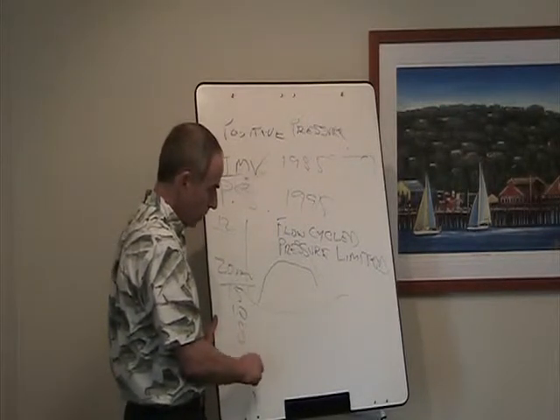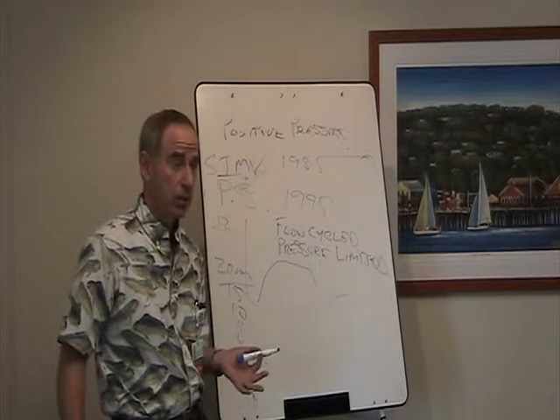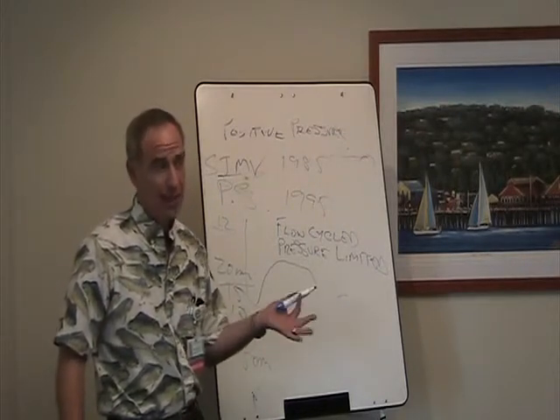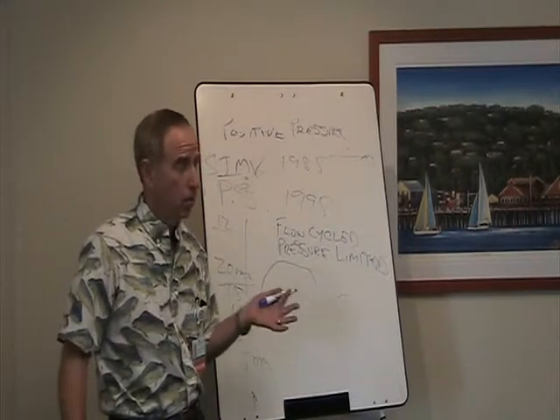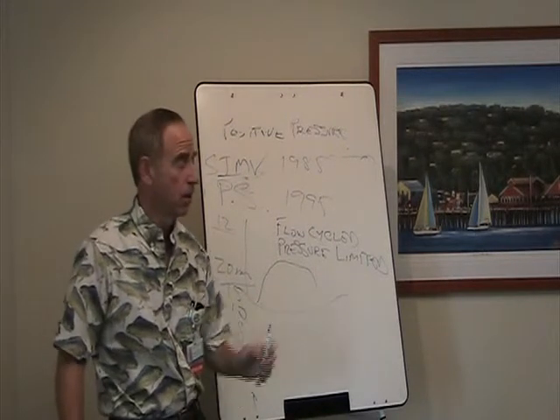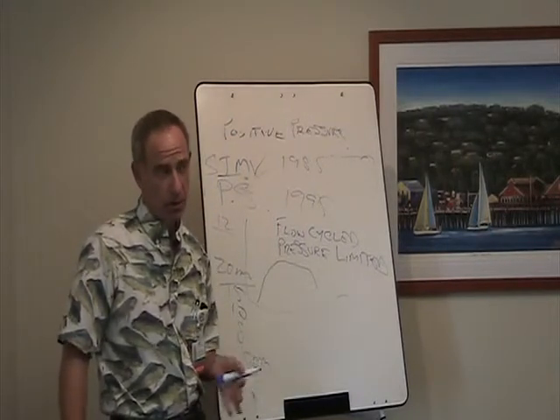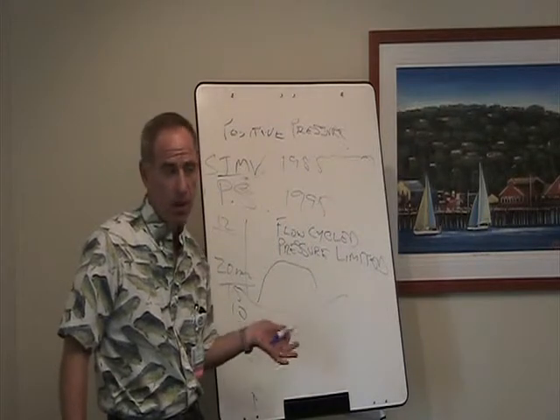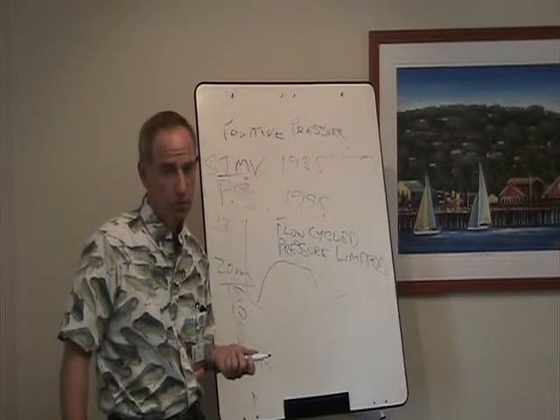When you get down to about 5 centimeters of pressure, the idea was that would be the amount of pressure required to overcome the resistance in the endotracheal tube. And you could probably extubate them from 5 centimeters of pressure support. Now we have tube compensation, which is really a type of pressure support, which, based on the size of the endotracheal tube and the patient's inspiratory flow, actually adjusts the pressure support. So it's probably somewhere between 3 and 5 or 6 centimeters of pressure support equivalent. So when we have them on that mode of ventilation, or on tube compensation, they're basically doing all the work of breathing, is the idea. Okay?